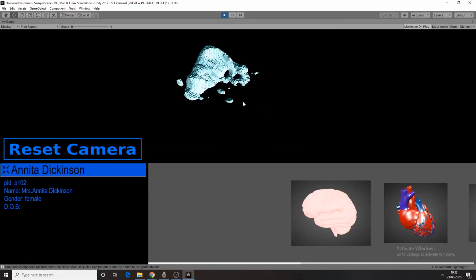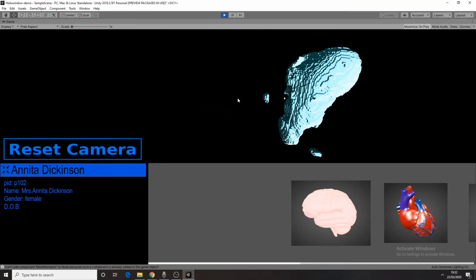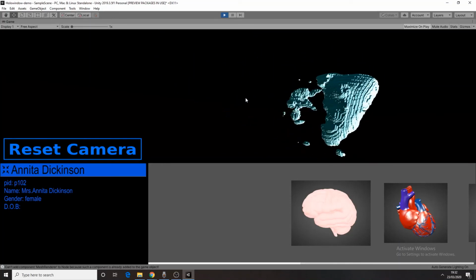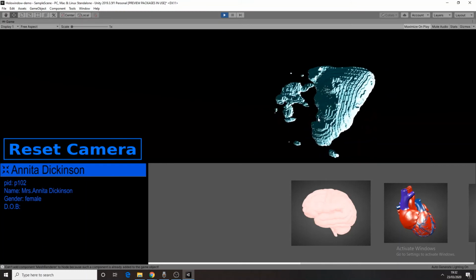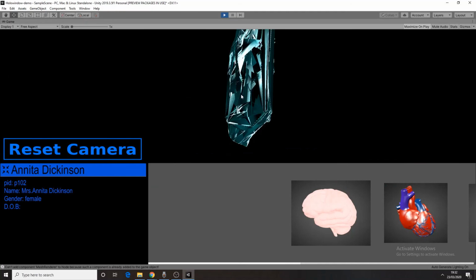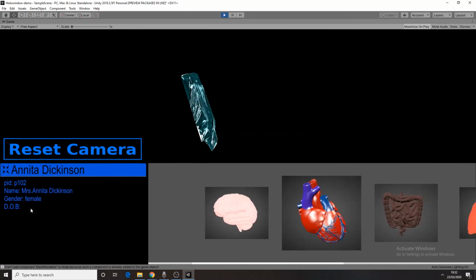We will now demonstrate the key features we have implemented. As of this video, we have successfully implemented the core deliverables. As such, we can load CT scans from the Holo repository at runtime, populate the UI with selectable holograms, and display patient data on the screen for viewing.